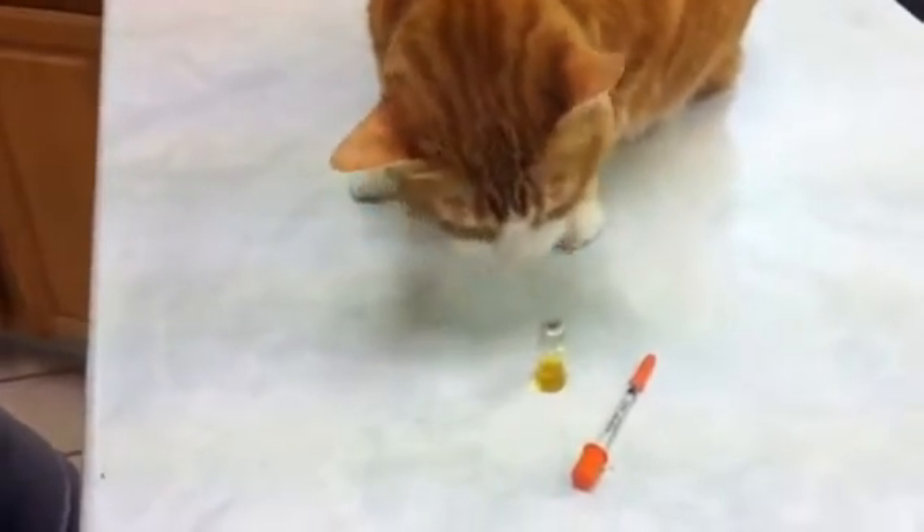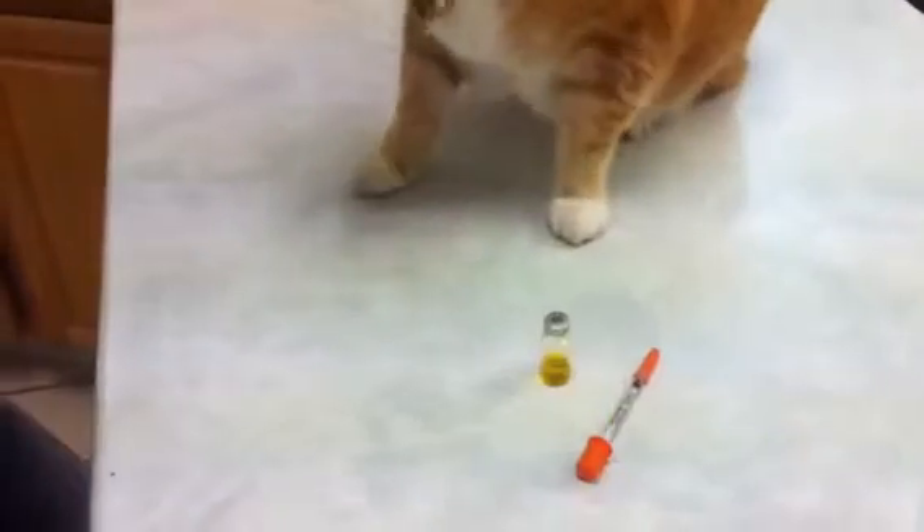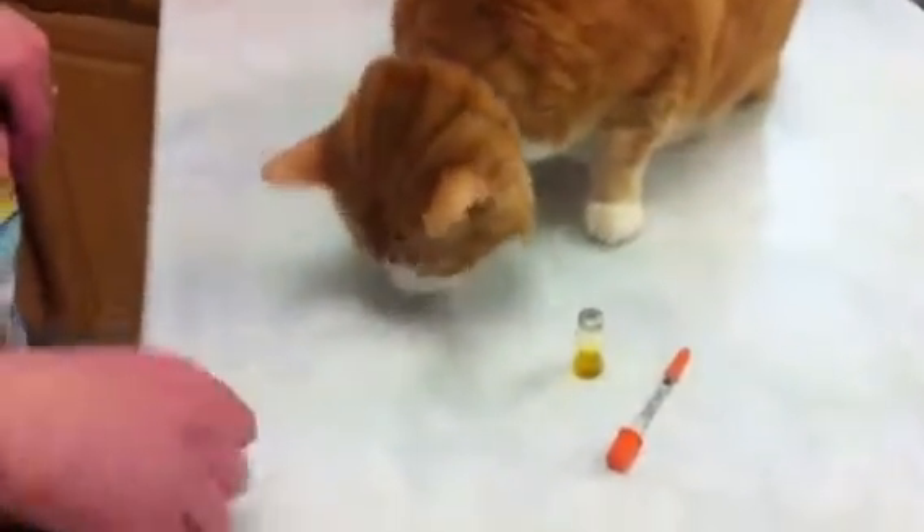This is the cat doctor, and today we're going to be showing you how to draw up insulin and administer insulin to your diabetic cat.